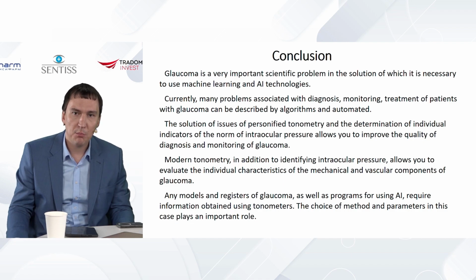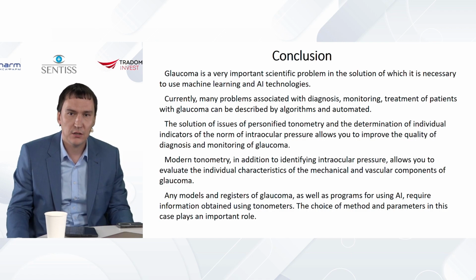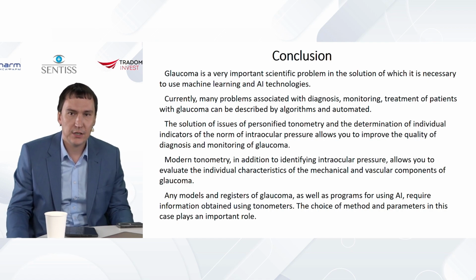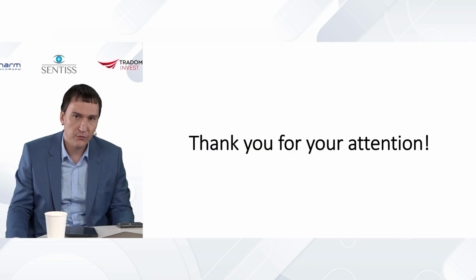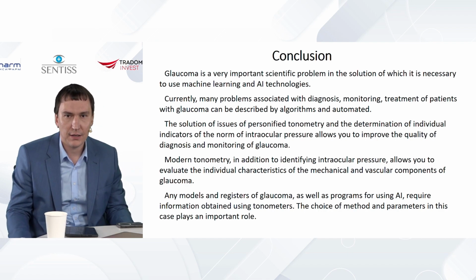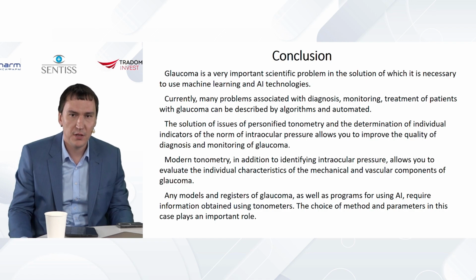A personalized approach to the management of IOP and, in parallel, measurement of biomechanical parameters, blood flow parameters, and some other data during the tonometry study is important not only from a clinical position because it clarifies the result, but also because it extends the option to use AI in this area, because at this very moment tonometry in the models which are related to the use of AI is still quite limited.